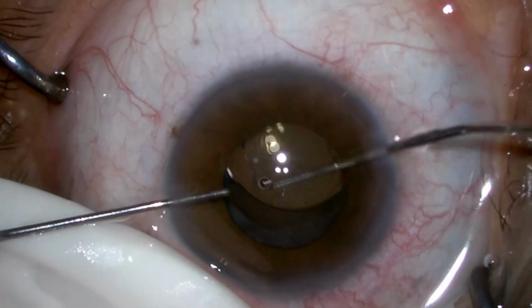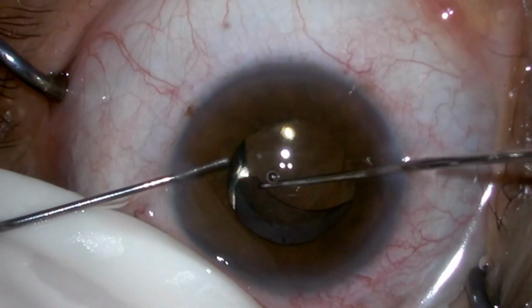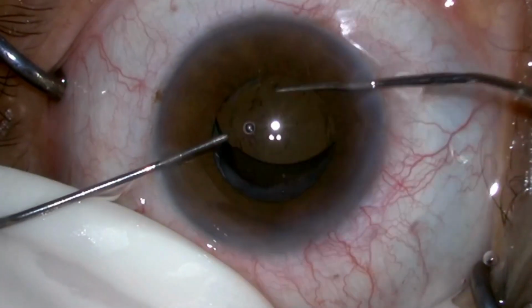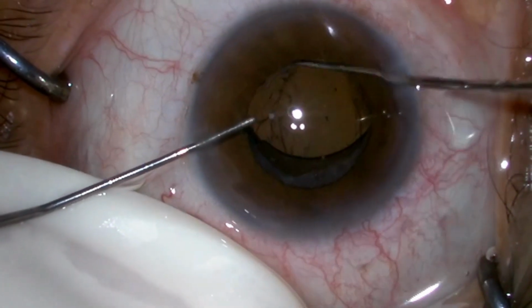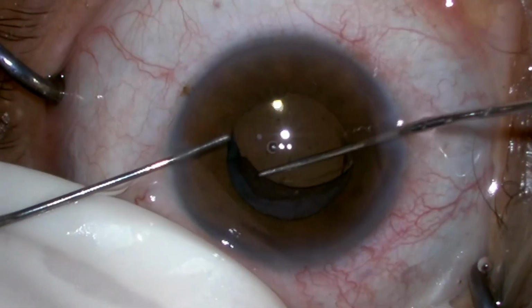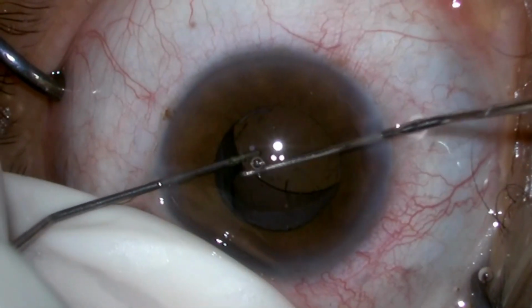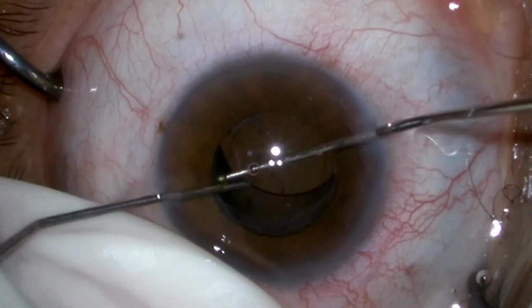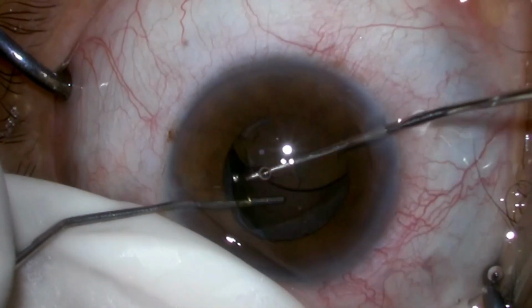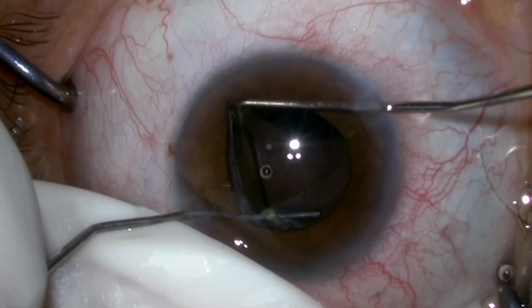See how adherent it is. With the help of this second instrument, the Y pusher, I am trying to stabilize the capsule and pull out the haptic which is stuck, but it is very much adherent.